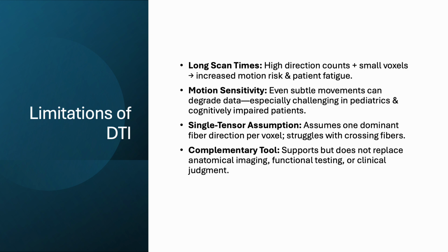From a modeling perspective, DTI uses a single tensor approach, which assumes that each voxel has one primary fiber direction. In reality, though, many voxels contain multiple crossing or diverging fibers, so advanced techniques are needed to fully capture that complexity.